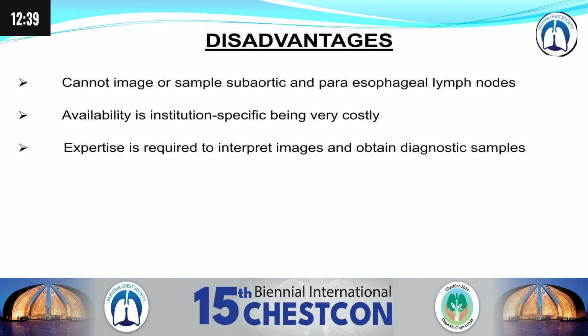But we cannot reach some lymph node groups, as I already told, such as the subaortic or paraesophageal lymph nodes. It is also costly equipment, and it is available in few institutes in Pakistan. And to use it, we need a lot of training.